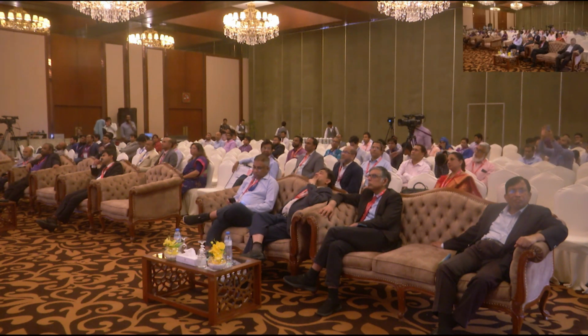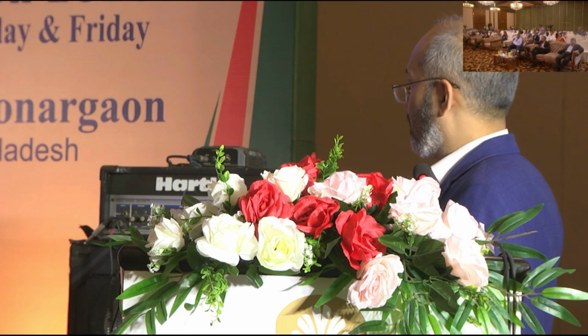We can see that in the caudal projection. Can we just see the caudal projection? And that's quite visible here. That's a very big chunk of eccentric calcification, as is seen in this projection.